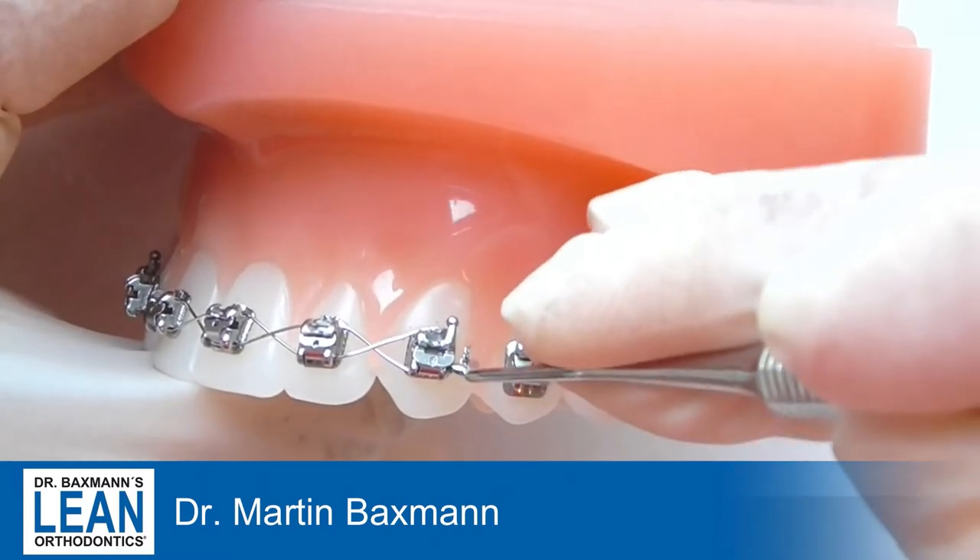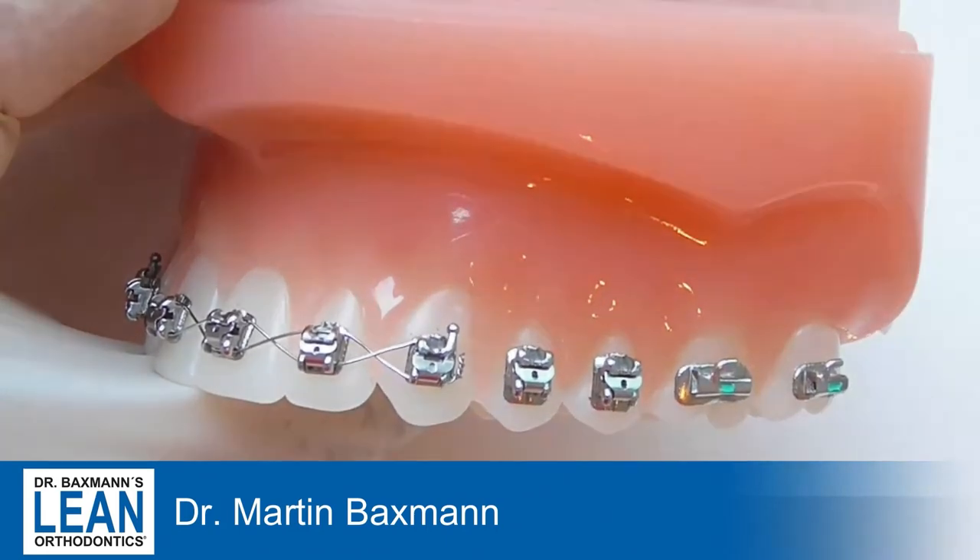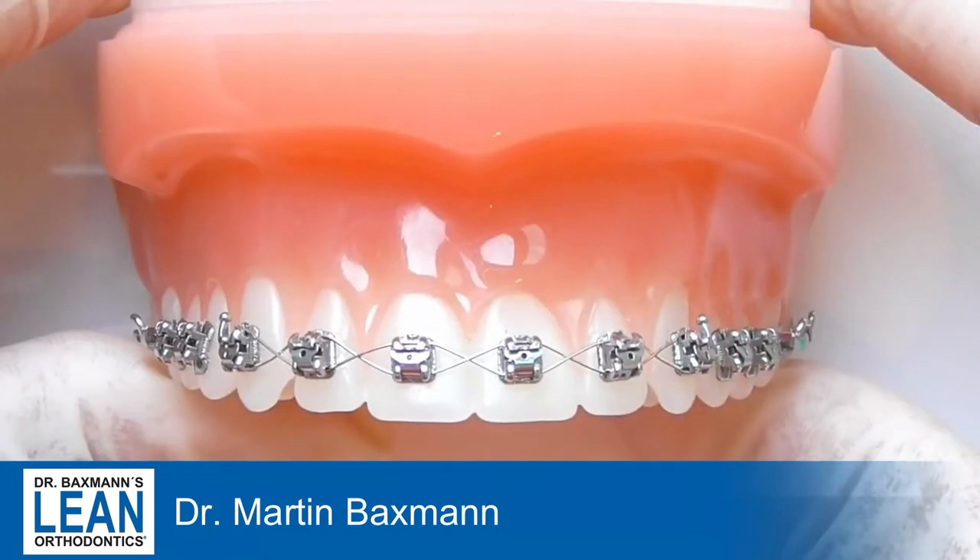If you cut it too short, that will be difficult — there will be something sticking out, and that's always problematic for the patient.